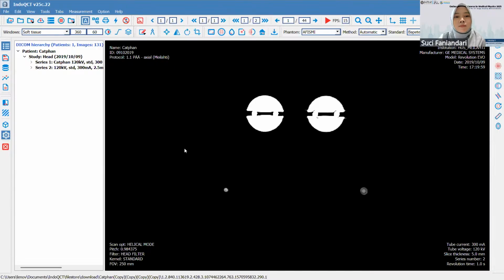So you have to upload your own images to populate the server first before searching all kinds of images. In this example, I've previously demonstrated the server has been populated with many images that I manually uploaded before.